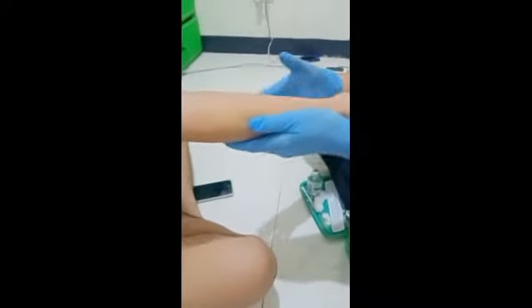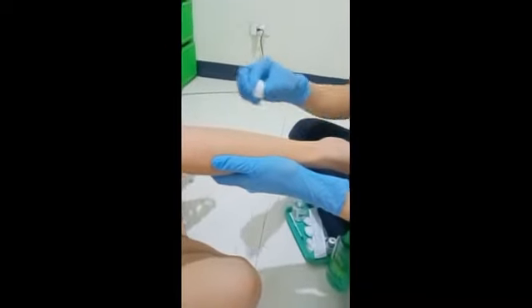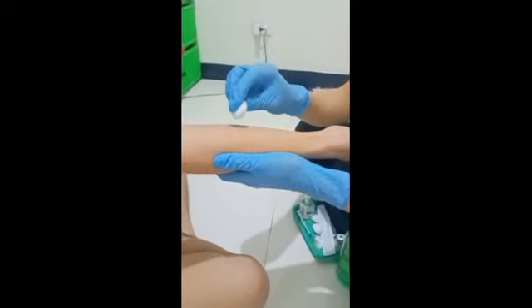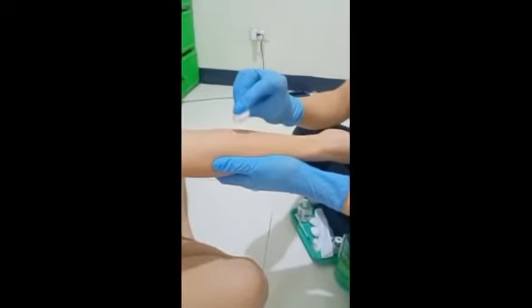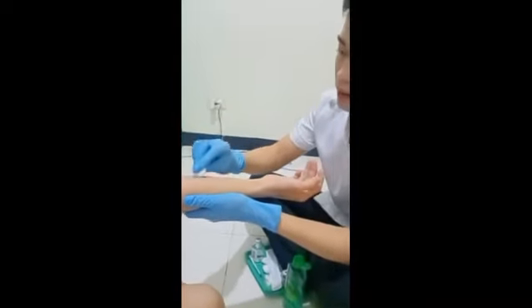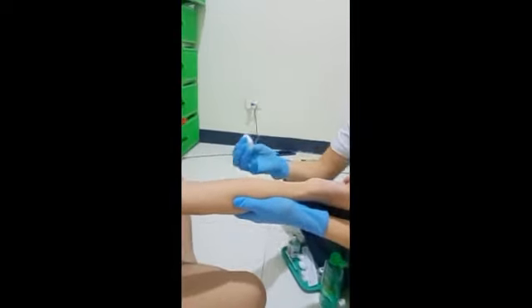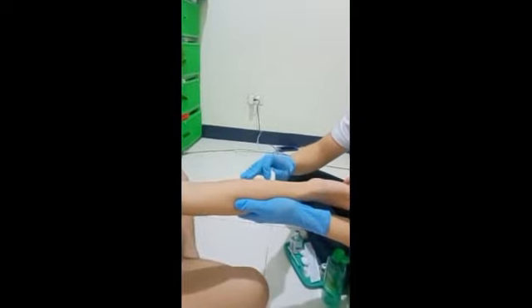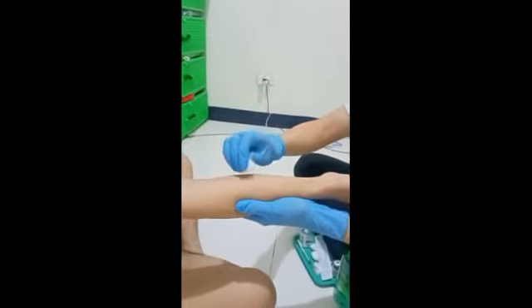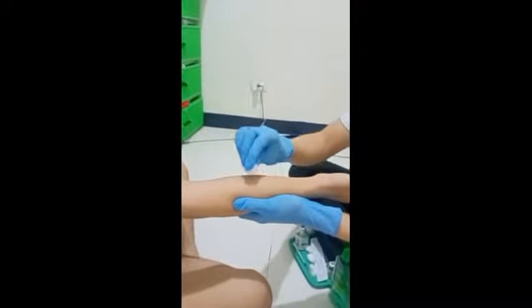And so we need to wipe the excess slightly or gently. It's like this. If you can see, the skin test for the patient is raised, just like this. So this is the intradermal injection for skin test.